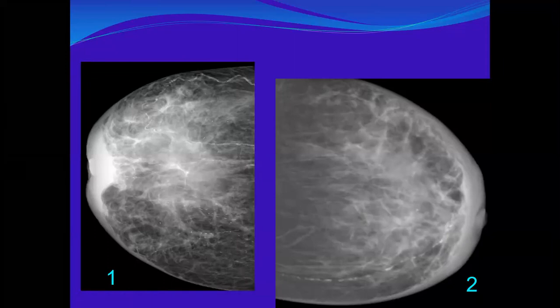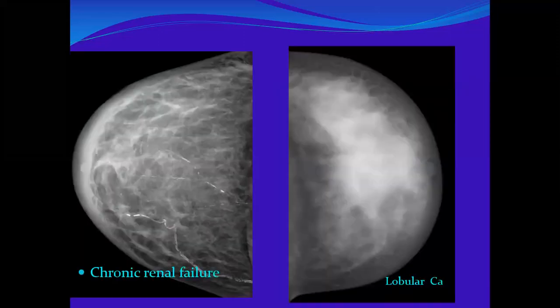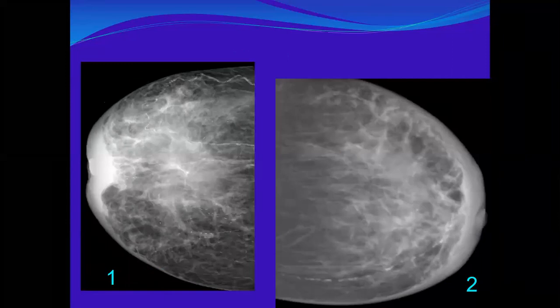Even with a systemic cause of edema, sometimes, if the edema is much more, you might see some nipple retraction, but usually not as much as the edema, unless the cause is chronic and long time and there is dependent edema. And here I could find some global asymmetry. I need to clarify this global asymmetry to make sure there is no underlying focal lesions. So I will report it as suspicious.